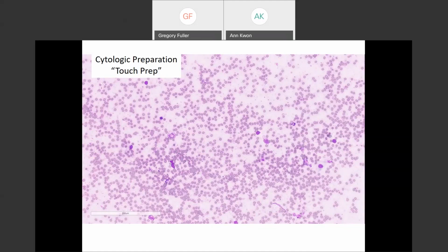Look, there's a problem. This is a true touch prep on an intraaxial lesion, a ventricular lesion. I'm fine with doing a touch, but if you do a touch on anything except a known shedder, what are known shedders? The small round blue cell tumors that have no junctions and no long processes. Medulloblastoma, sure. Pituitary adenoma, always. Lymphoma, absolutely. Most necrotic metastatic tumors, metastatic carcinoma, metastatic melanoma, yes. But on a suspected primary CNS tumor, fine, do your touch prep, but you're likely to get red blood cells.